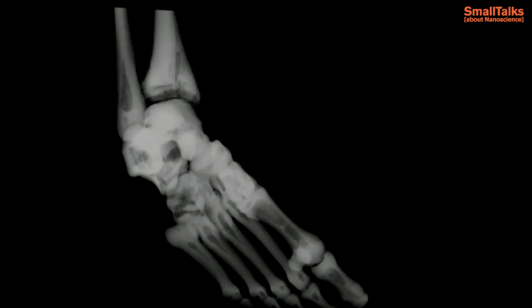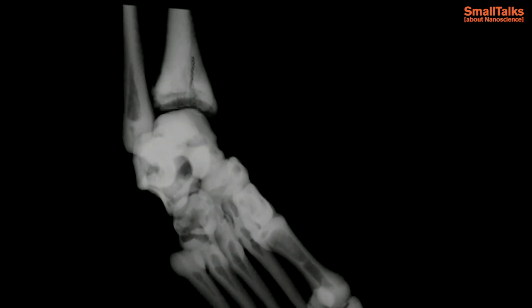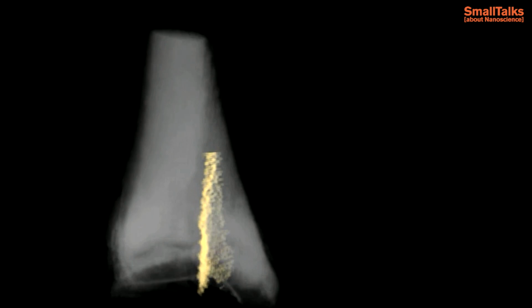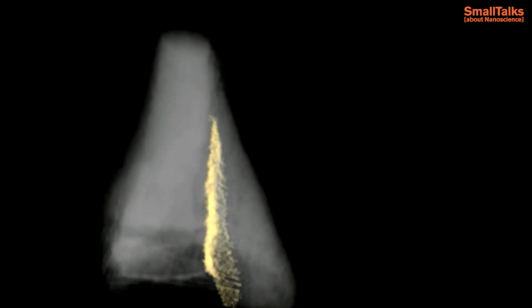In this video, you see the result of such a measurement. It shows the 3D reconstruction of my foot and ankle, and we can here zoom in on the shin bone, which is the injured part. When we now look at it from this perspective, we can clearly see a crack going up through the bone and through the full width of the shin bone. So by using X-rays, it was confirmed that my ankle was broken.